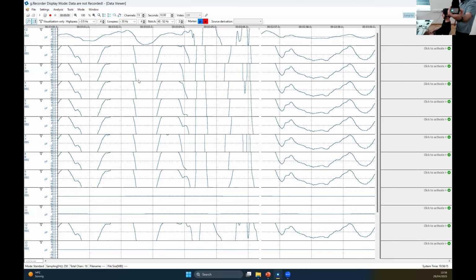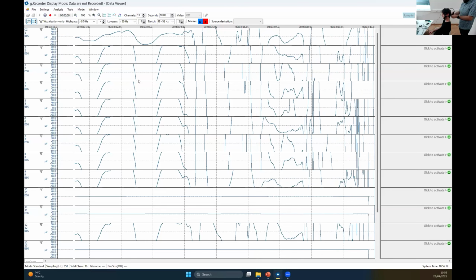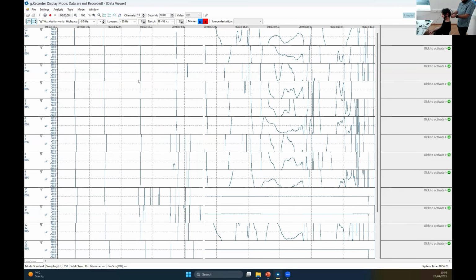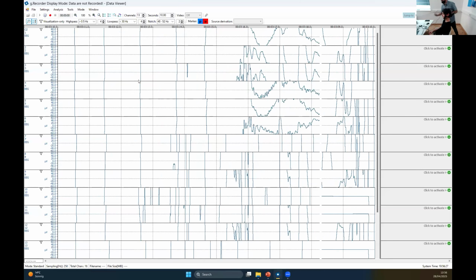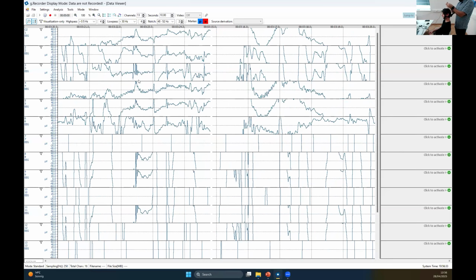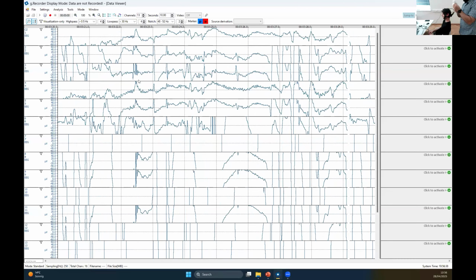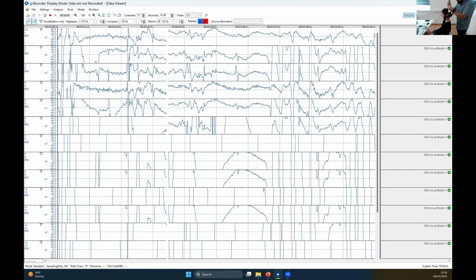Obviously, like usual, you need to connect the amplifier to the head. In this cap, sorry, but yes, this is not good. Now it's more comfortable. We have a magnet holder, and then we can see already the signals getting better. Whoa. I need a signals getting better one by one.